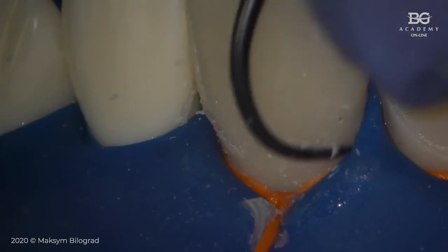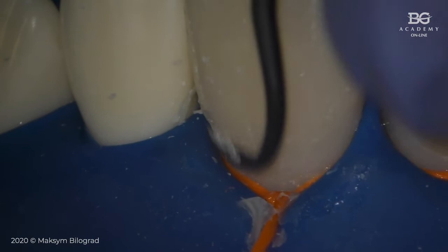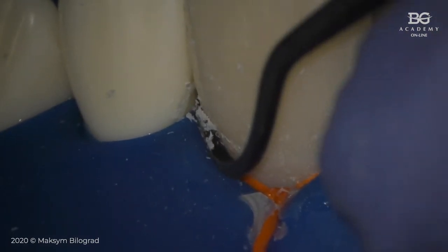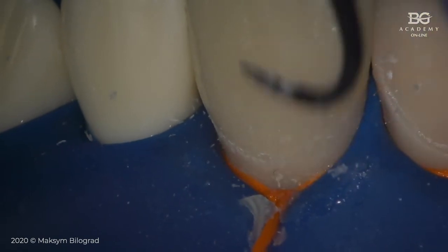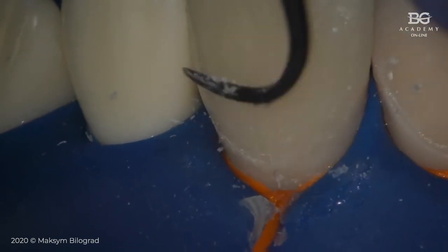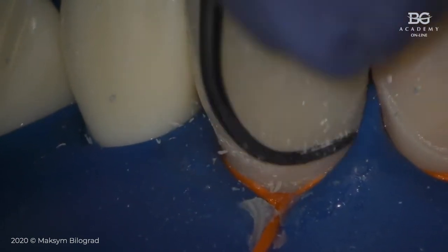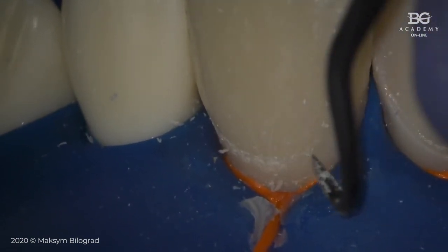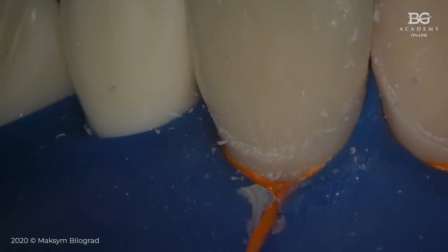Okay, that's fine. You can also use scalpel blade number 12. Number 12. Okay, good. If it was correct, this is the final step of your process of finishing. If not, for example, I have some resin cement here, I can go to another step.